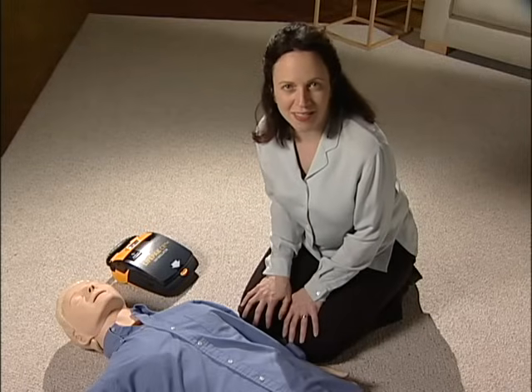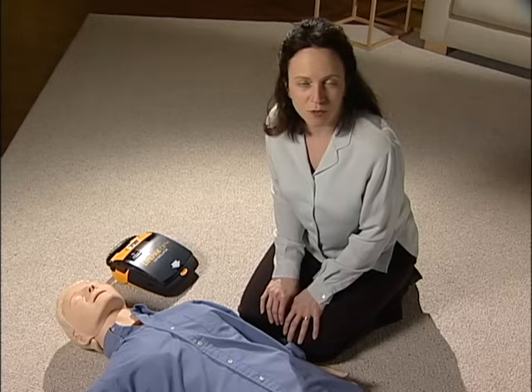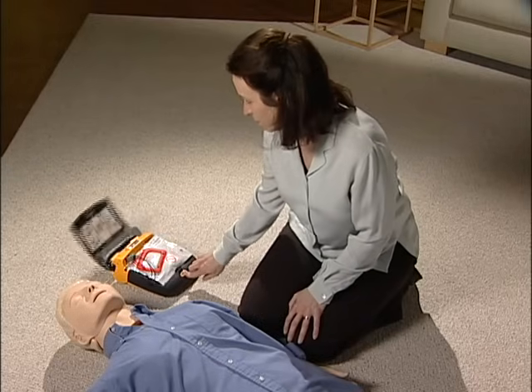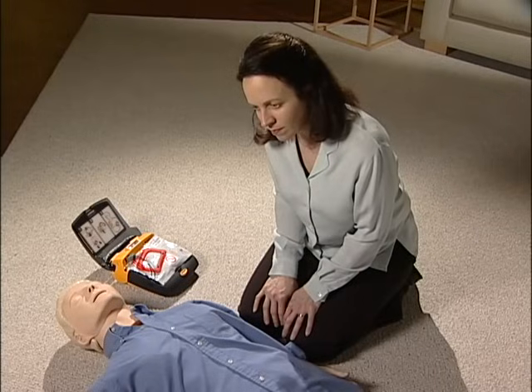Okay, let's go through that in detail. Set the LifePak AED on the same side of the patient as you. Press the on-off button. Call for help now. Remove all clothing from patient's chest.